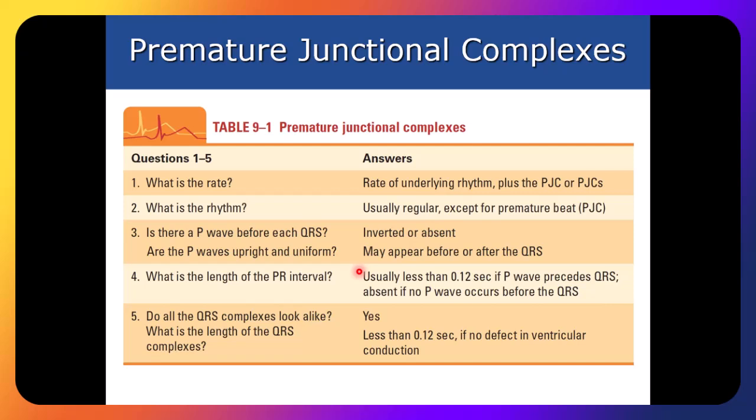Because the P wave is small enough. It would just get overshadowed. Remember, your whole right atria is about that size right there. And your heart itself is this size, and 75% of your heart is your left ventricle plus your right ventricle. Definitely, a shout out to Morgan and Morgan, size does matter. And in this situation, size doesn't matter. So again, we cannot see a P wave, or it could occur after the QRS, which is kind of weird the first time that you see it.